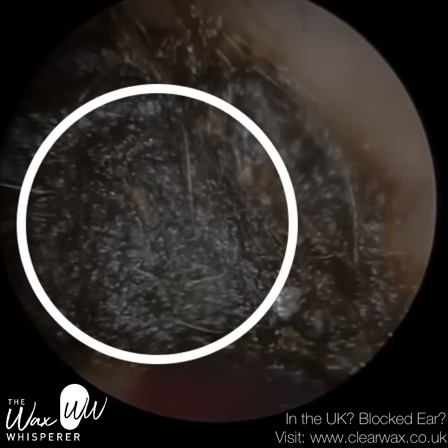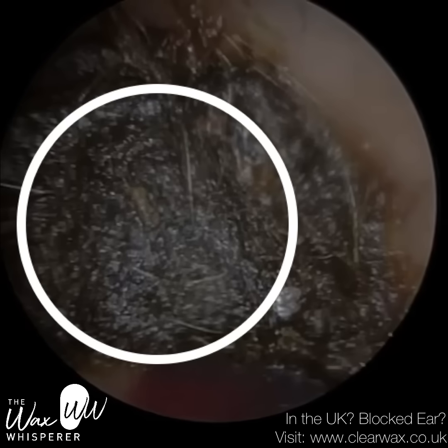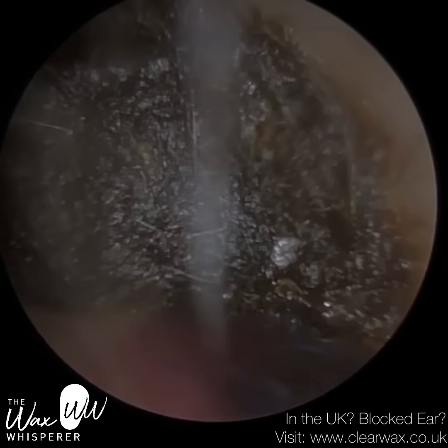This is a patient who attended with severely blocked earwax, really impacted deep into the ear. They were insistent they didn't use a cotton bud, but you can see there the indentation of the cotton bud.